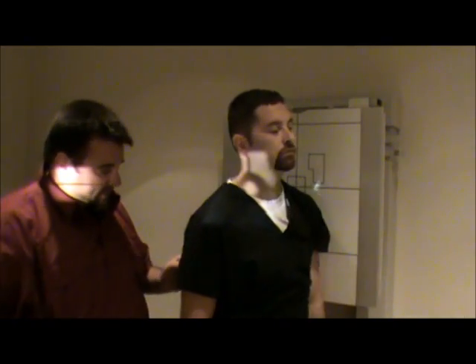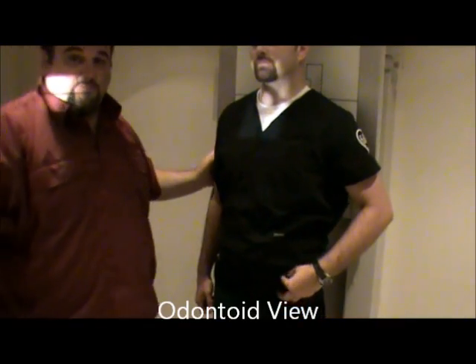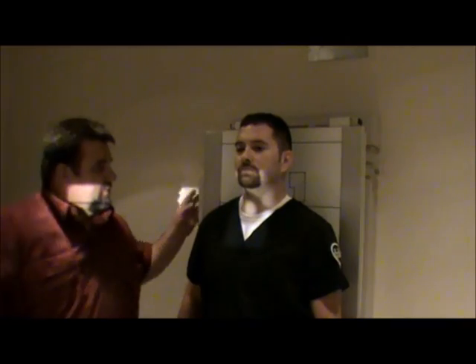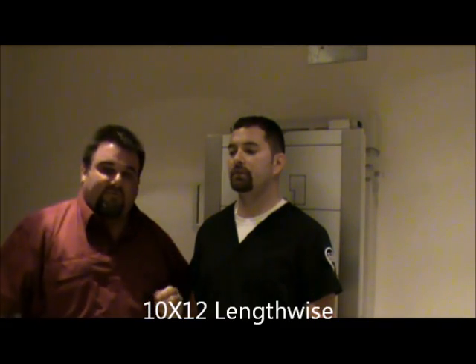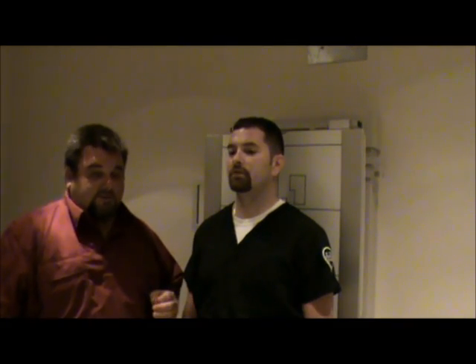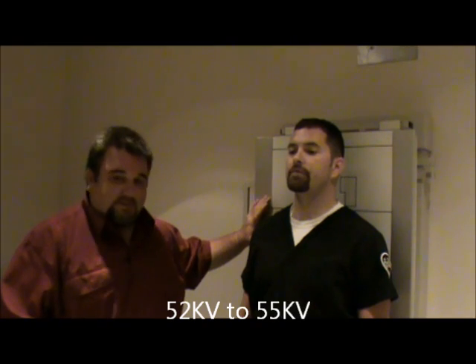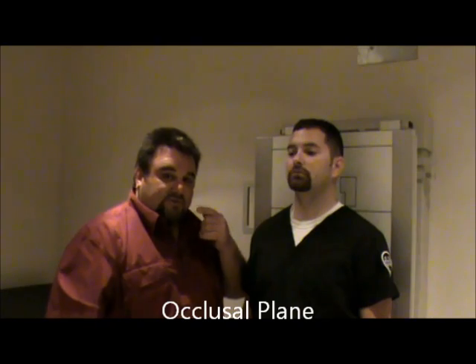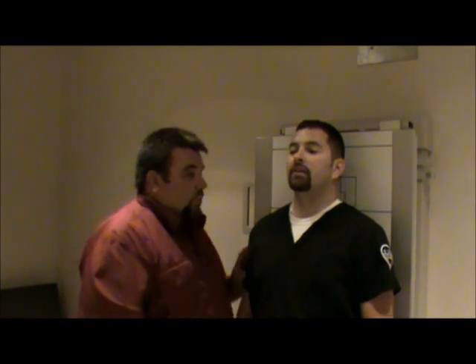Next we're going to do an odontoid view. The patient turns and puts their back against the board. We need to make sure the shield is turned to the front. Film size is 10 by 12 lengthwise. Technical factors go down to about 52 to 55 kV, center cell, automatic exposure control. We're trying to see C1 and C2. We want to get the occlusal plane — an imaginary line between the chewing surface of the teeth, the mastoid tip, and the base of the skull — perpendicular to the IR, with the mouth open.